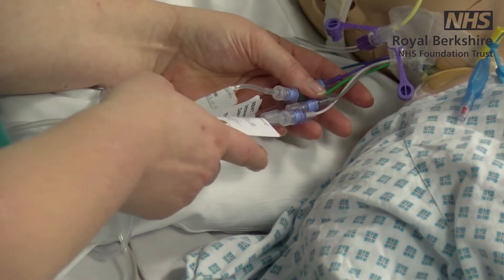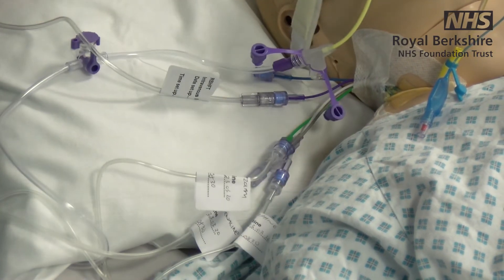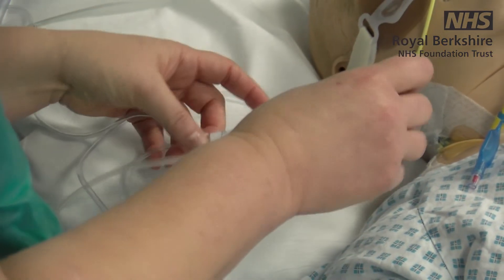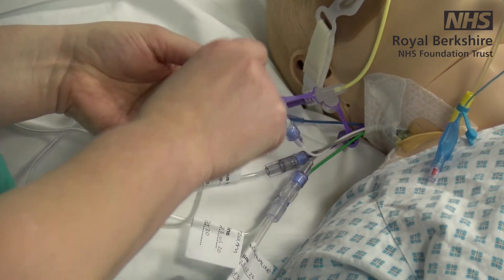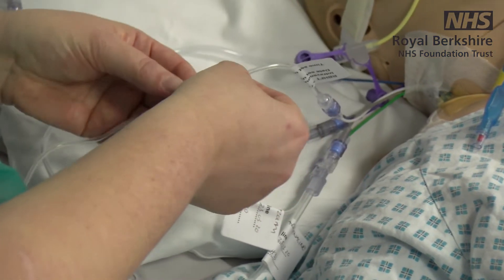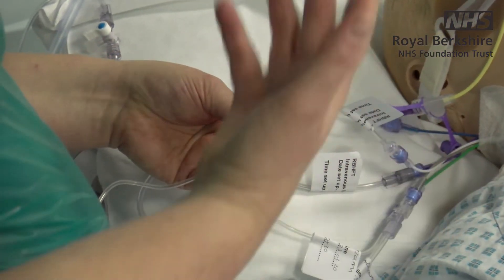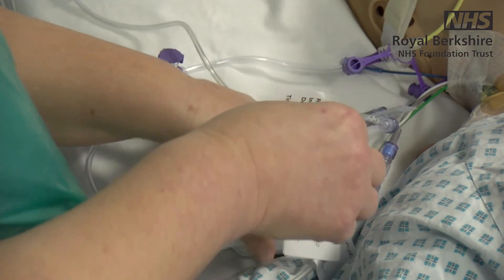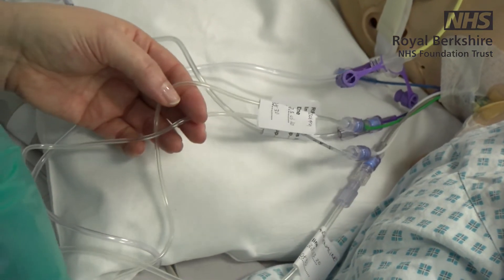It's changed a lot from when I started in intensive care — we used to have lots of three-way taps in a little row, but very few places use those anymore. We will label all our lines with the date and time they were started, which guides you from an infection control perspective on when to change them, and we'll also often label which drugs are running on each line. In an emergency you need to quickly identify which line is which, because many of these patients will be on more than two or three infusions depending on how unwell they are.